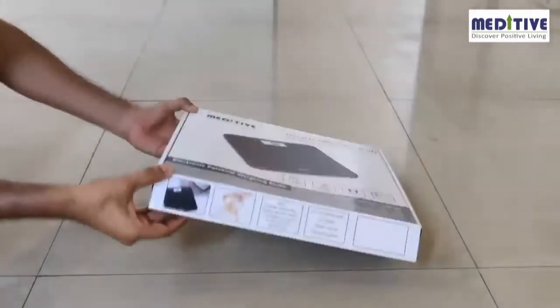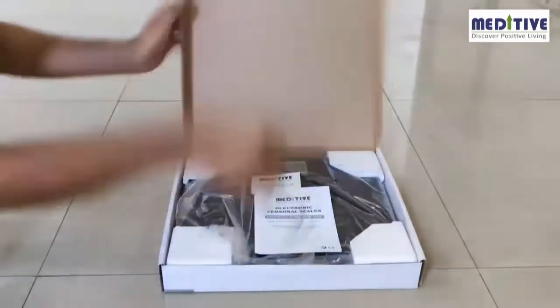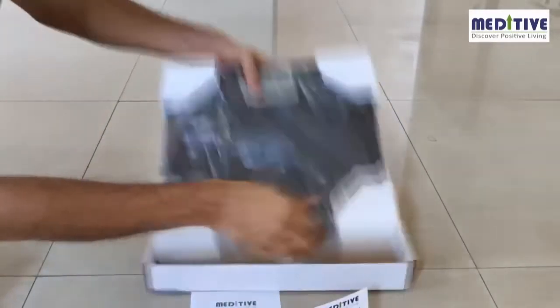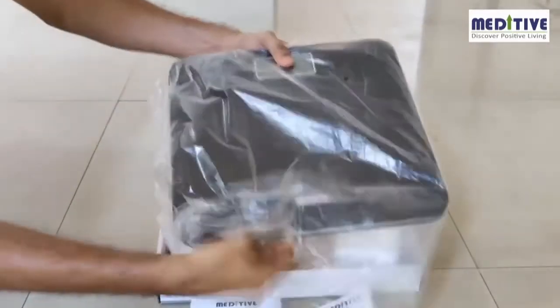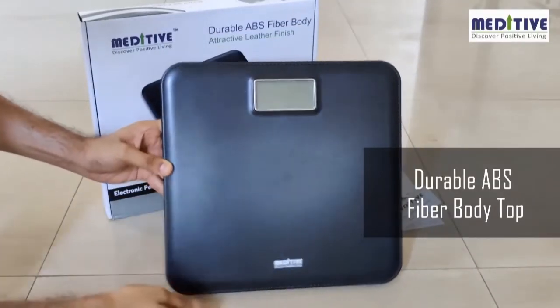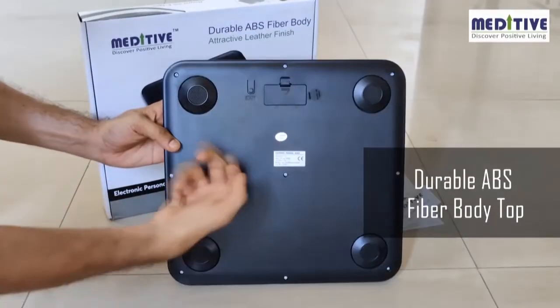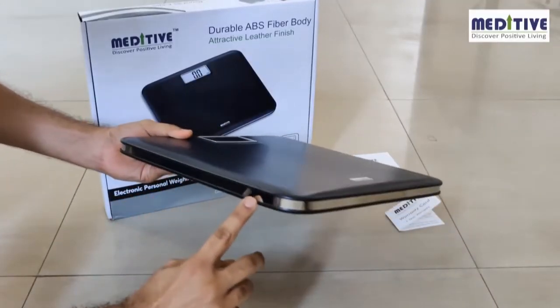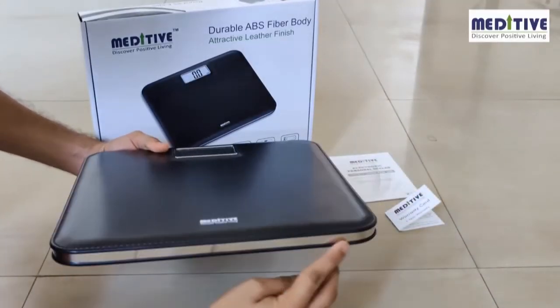The Meditiv Human Weighing Scale is designed using a durable ABS fiber body top. Please read the instructions on the box and the user manual to understand the product and the warranty. The scale has a strong fiber platform and base, so there is less chance of breakage unlike the usual glass body scales. The edges are curved so that there are no sharp points, ensuring safety whenever it is kept on the floor.